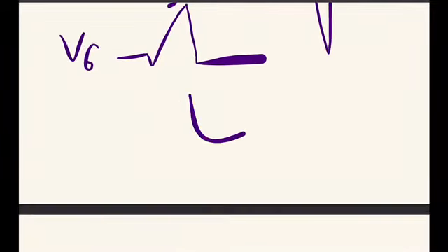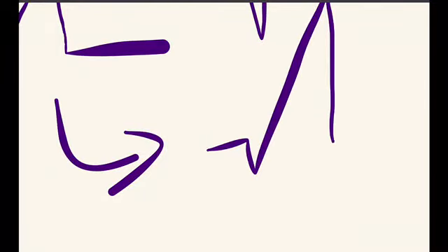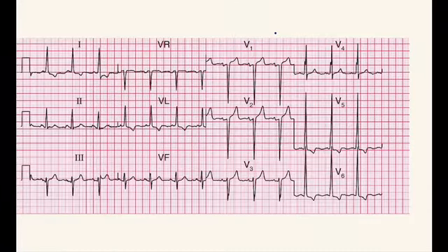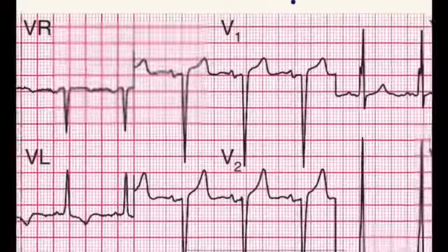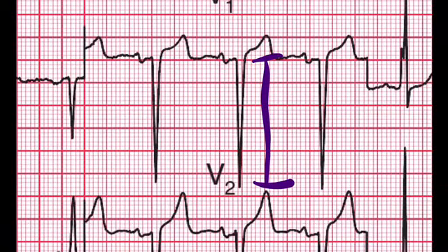Now abnormally, after left ventricular hypertrophy, a Q wave and a peaked R wave can be seen. Okay, peaked R wave can be seen. So now let's discuss this ECG, which is obtained from a person having left ventricular hypertrophy, and as you can see, there is a long negative S wave in the V1 lead.